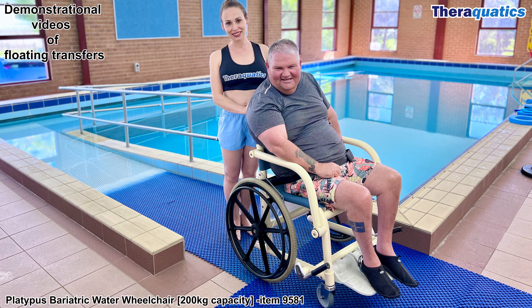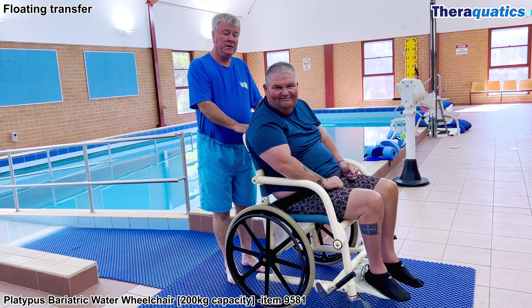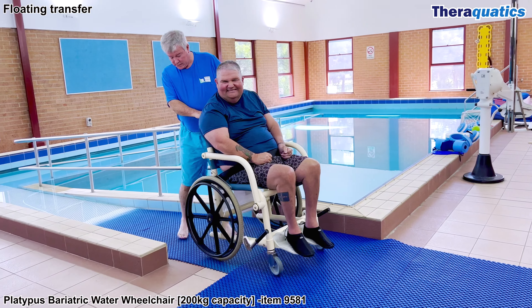Platypus Bariatric Water Wheelchair, item 9581. Suitable for pools with a ramp and for larger swimmers with a physical disability.